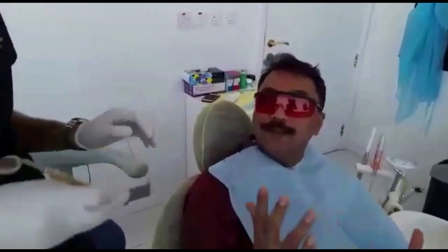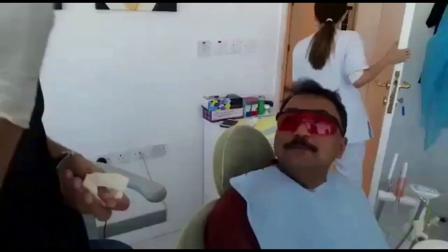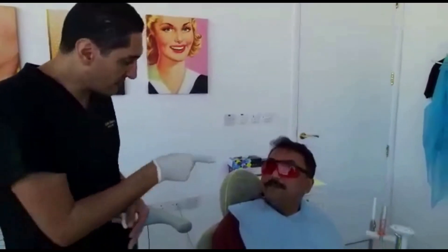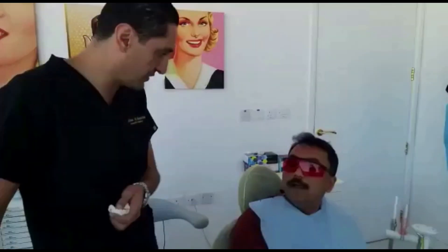I did it once because I could not believe it — I had to try it myself. Something drilling in my bone, oh what's that? Yeah. I needed three drills to get to three-quarters or more than halfway.